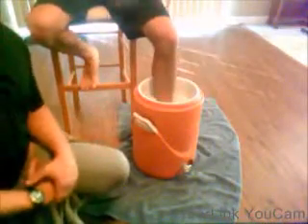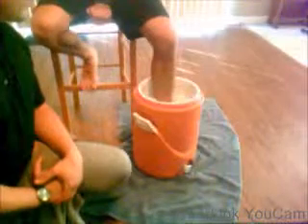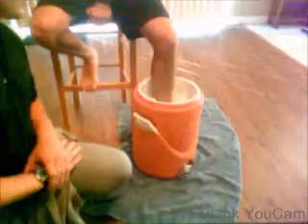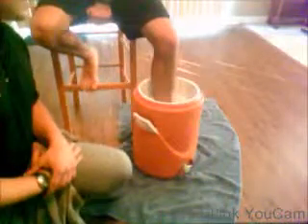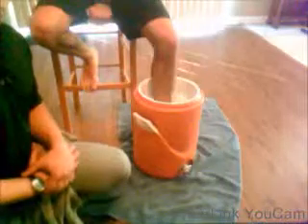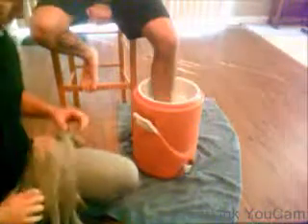So I would give the patient a timer here and come back probably in about 5 minutes to assess the look of the limb and make sure there's no hypersensitivity. The patient will sit here for 20 minutes, and when the timer goes off, he could remove his foot. So if the timer did go off now, we want to make sure the patient removes his foot.